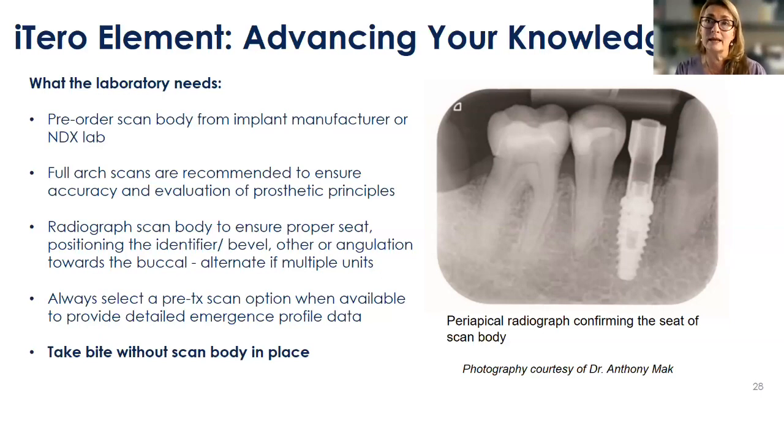When it's time to take the bite registration, please make sure that the scan body is removed and that healing cap or healing abutment is placed back. I would say 99% of the time, the patient is not able to occlude with the scan body in place.